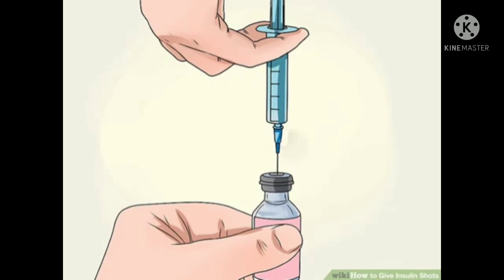Check the syringe for air bubbles — there should not be any. If there are, tap the syringe so the bubbles float to the top and inject them back into the insulin vial. If you see no air bubbles, put the loaded syringe down carefully and then proceed to select your injection site.